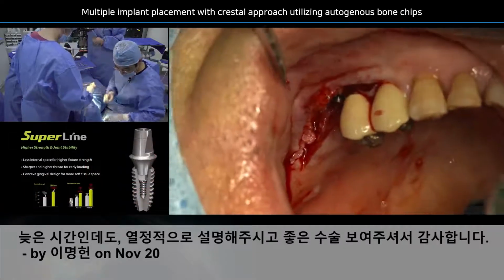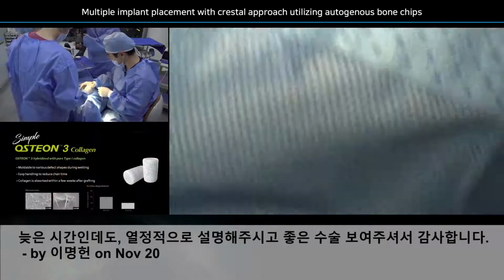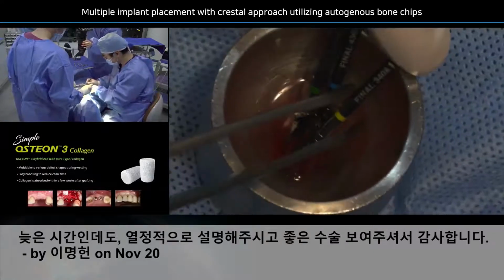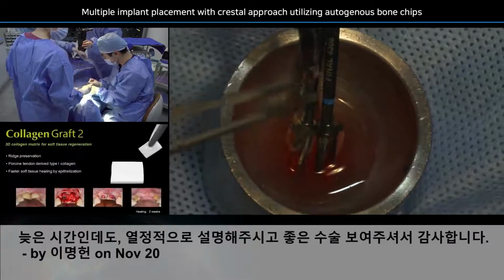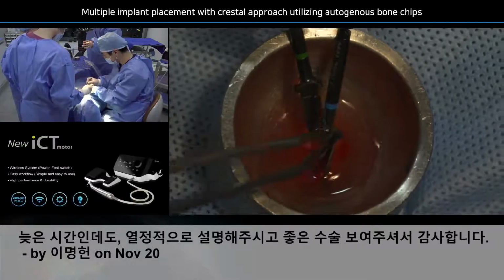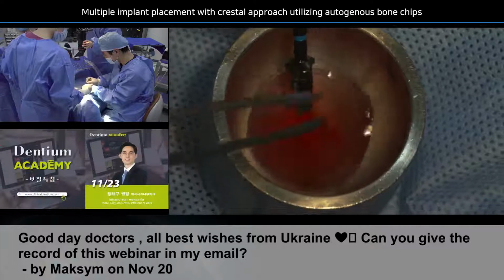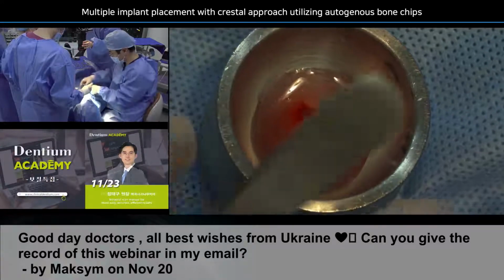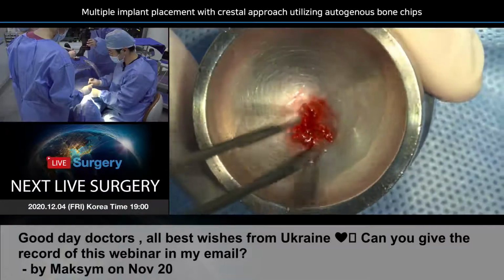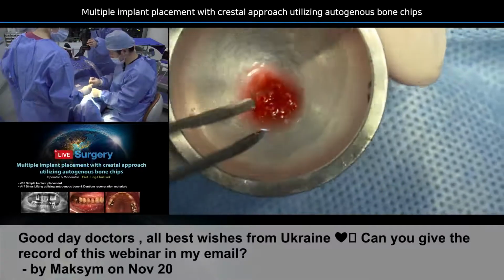Now finally, we are ready for the bone augmentation. So if you can see here, this is the autogenous bone captured inside the drills. You remove the bone from drill number one, and you remove it from drill number two, and you remove more autogenous bone from the final drill. So, if you put your gauze here and you remove the lines, this is around 1.8 milliliters of osteotomy autogenous bone. So it's quite a lot of autogenous bone.